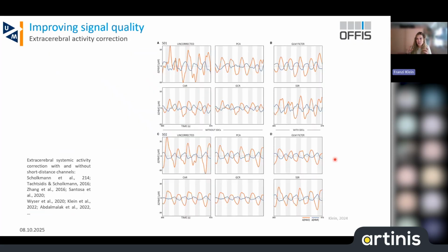So this was just a very brief version, but these are all things you should take into account. And now the next question is, how are you using that? Because as I said at the beginning, offline analysis is not the same as online. And of course, real time means that you have to apply that in a windowed approach and so on.